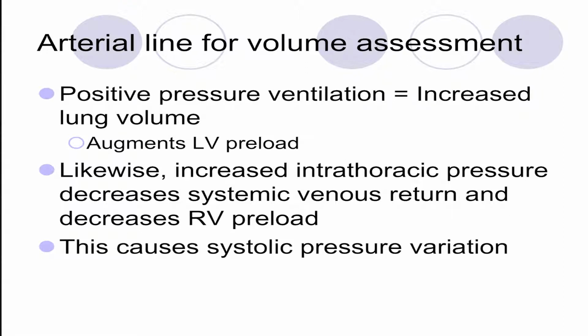You can also use art lines for volume assessment. So we've talked about how CVP is not particularly helpful unless you have a trend, but you can also see this in the A line.